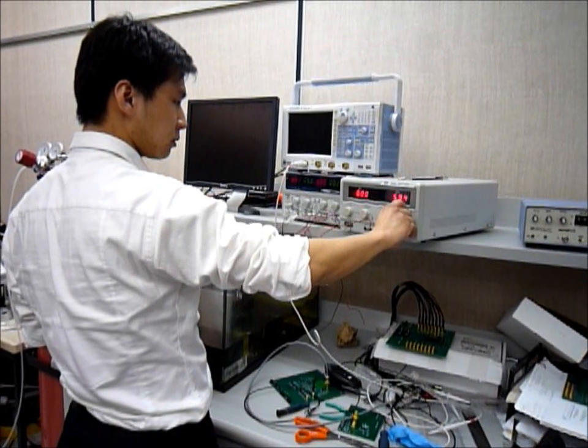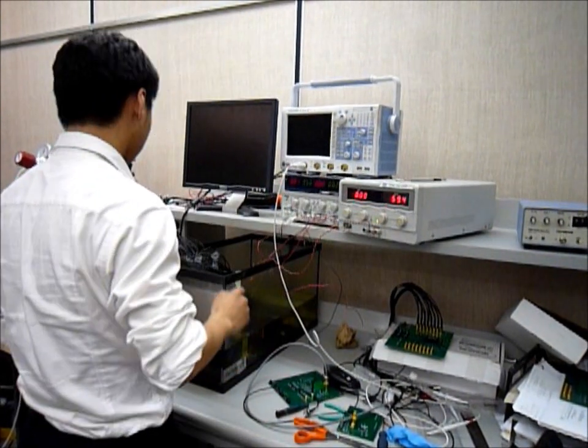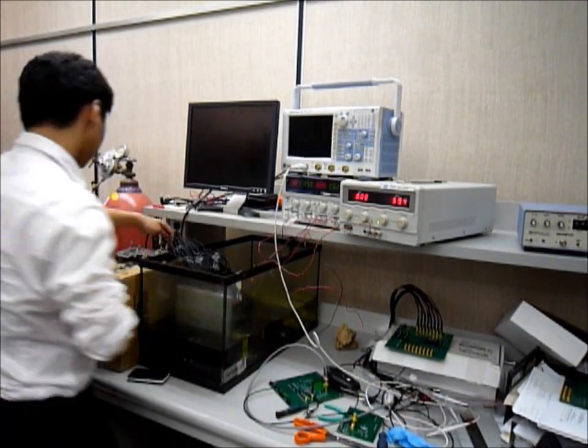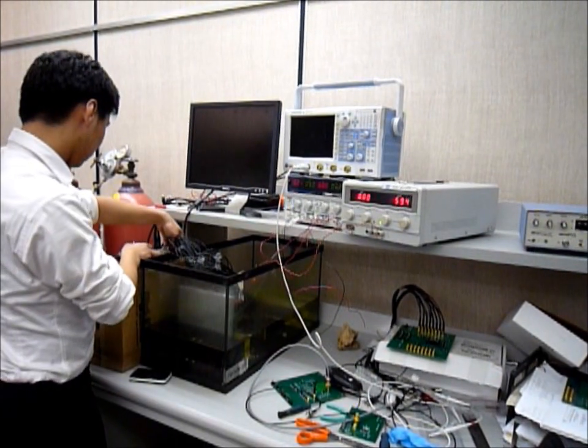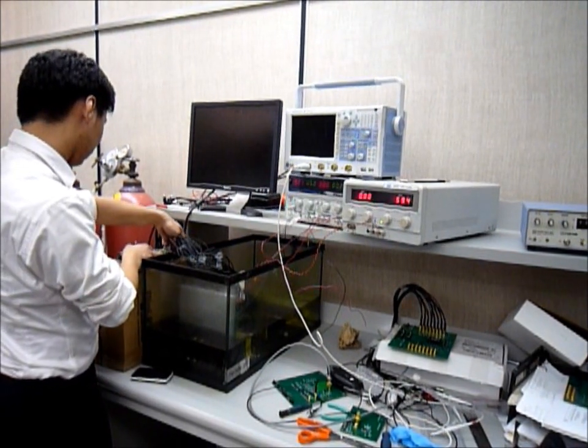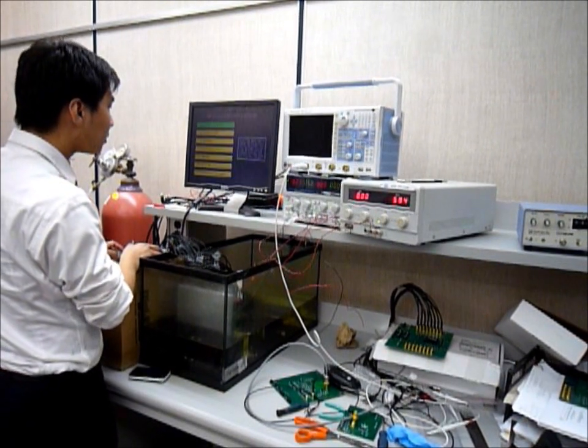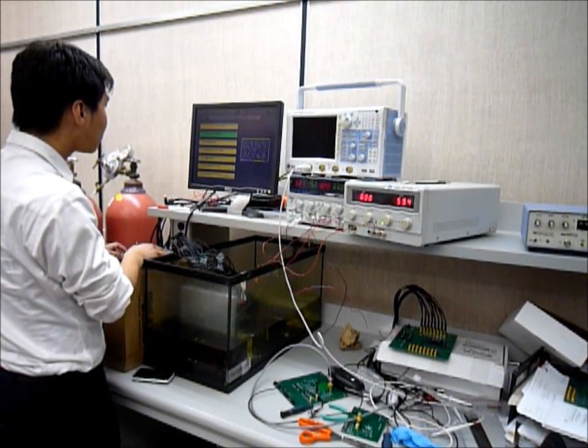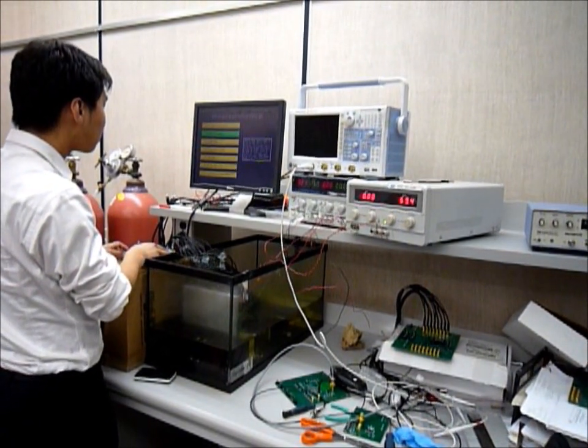We started by placing the CMUT directly into the socket on the main printed circuit board. The CMUT is extremely fragile, so we were very careful when handling the chip.